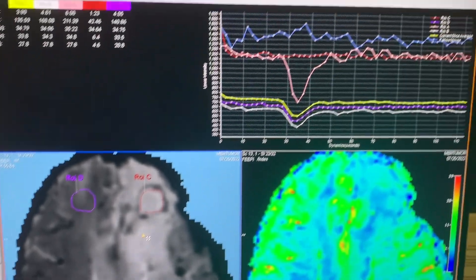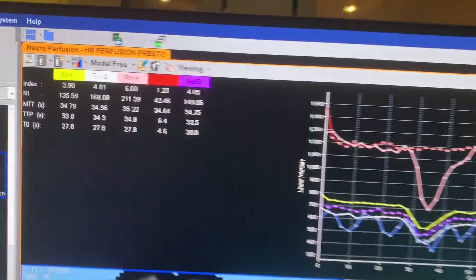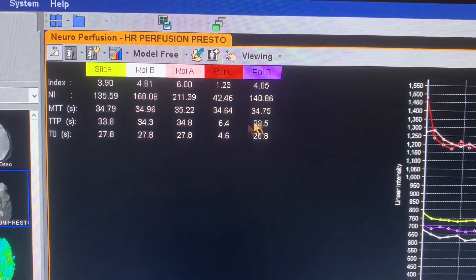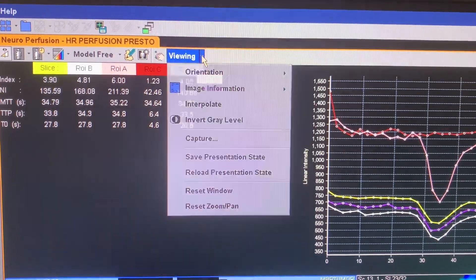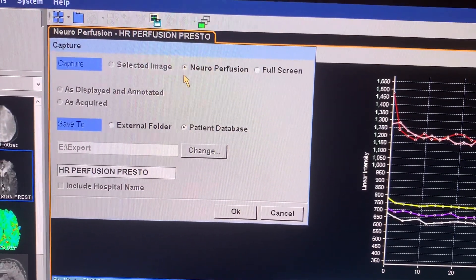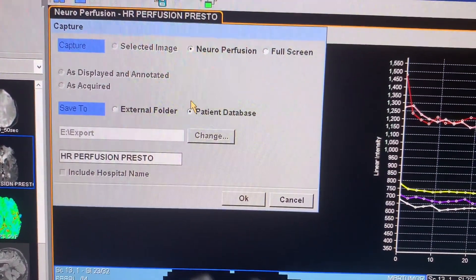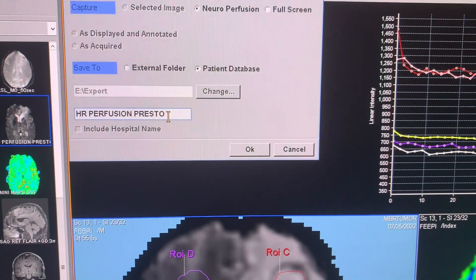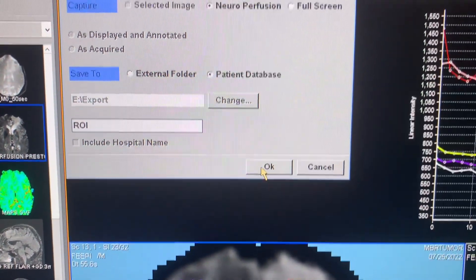In the top-right you'll see a chart. Importantly, the numbers shown should not be zeros — there must be a value there. Then go to Viewing Capture. Make sure 'NeuroPerfusion' is selected — that is absolutely required. Also select Patient Database, then type 'ROI' and click OK to save.